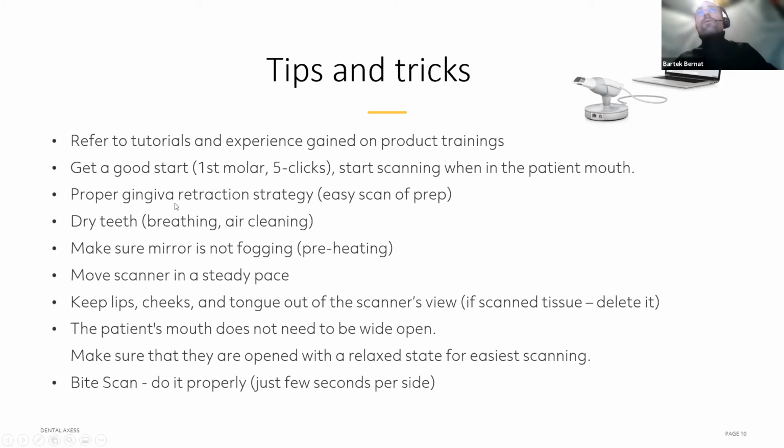Very important, if you are scanning for the actual preparation, is to have a proper gingiva retraction strategy. Use a cord if you can. Use a lot of air. So this is the next point here.